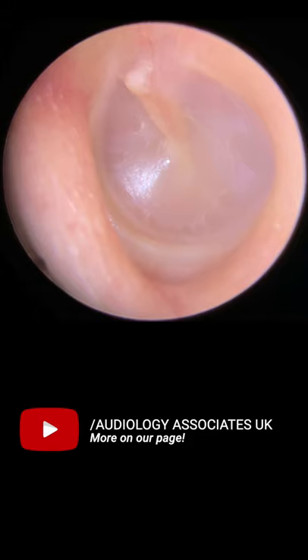Imagine the eardrum like a clock face. We're going to start at the 12 o'clock position at the top. We're looking for the tip of the hammer bone, and extending from that we're looking at a diagonal line — that is the handle of the hammer bone. It should be slightly prominent, but as long as it's not red or inflamed, that's healthy.